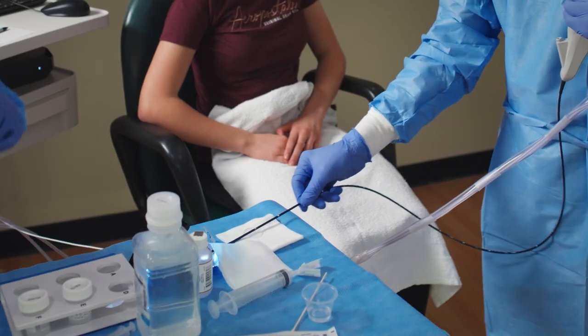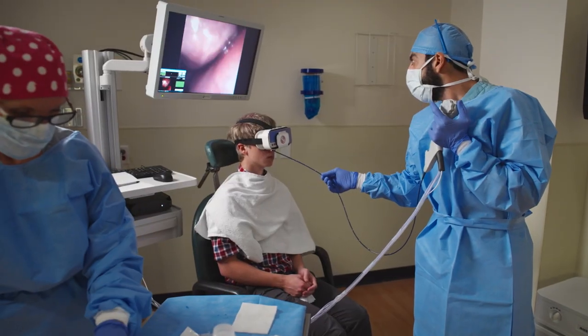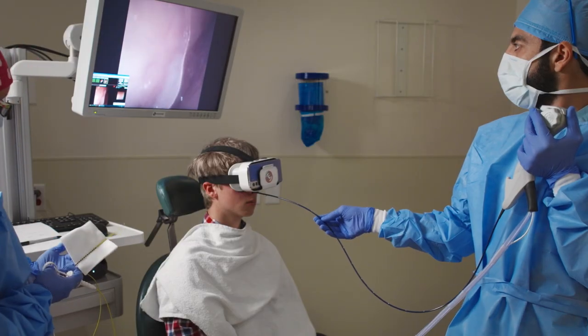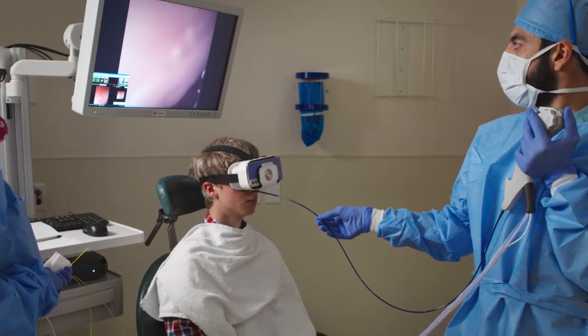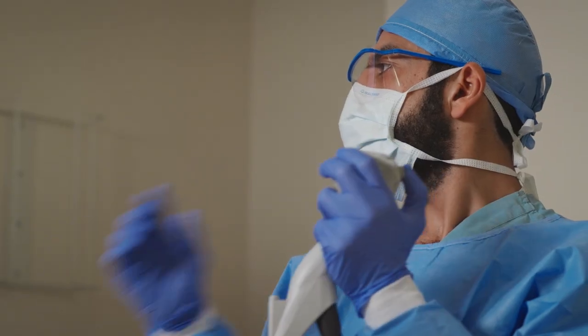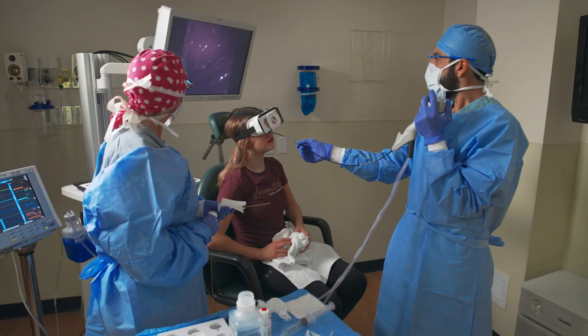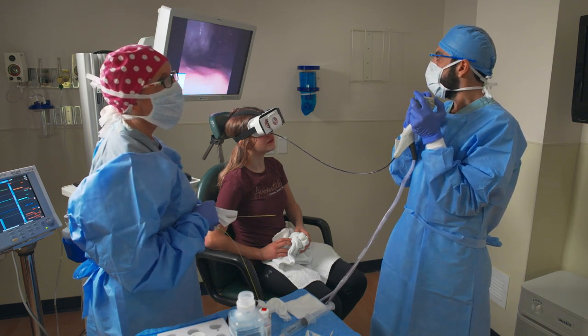After the doctor prepares the scope, they will slide the camera into your nose, where you may feel some gentle pressure. As it enters your throat, the doctor may ask you to swallow. The physician will guide the scope into your esophagus, then may proceed into the stomach and beginning part of your intestine. They'll use the camera to see the inside of your digestive system. You may feel the scope as it slides through your nose and throat.